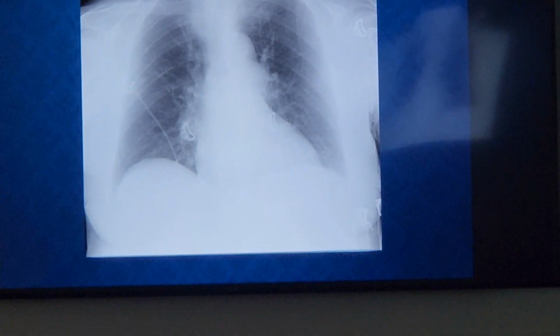That's Harris Health property. It's a dynamic range. When you say the S value was 10,000, were you looking at the S value on the machine you shot it on, or the image on Synapse? Image on Synapse. And you said it was with the portable machine, right? Here's the issue.